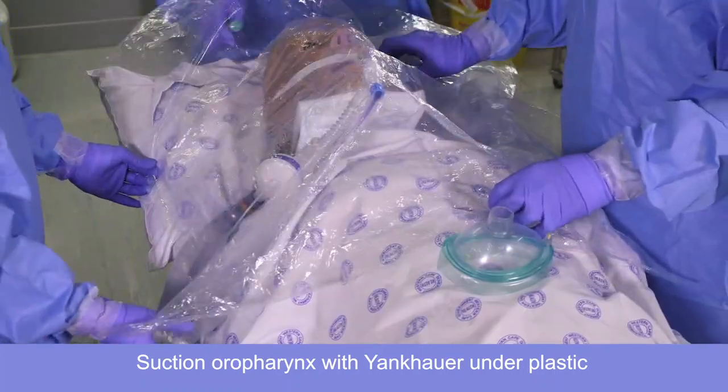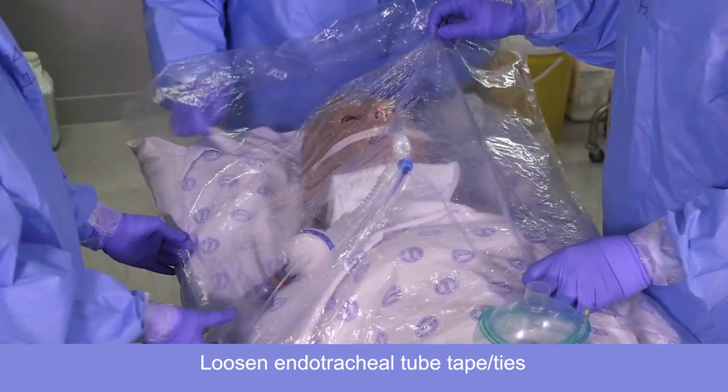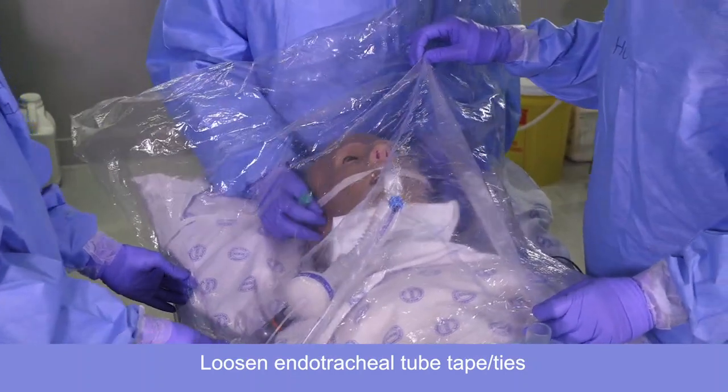I'm going to control this plastic sheeting. You can loosen the tube ties so long. Marietta, you're going to disconnect the circuit and put the mask on for us when we're ready.